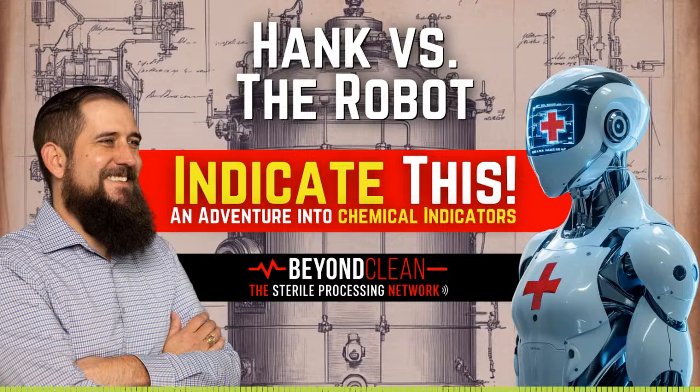You're onto something important here, Hank. The reliance on color change as a mode of interpretation has been both a strength and a challenge in the world of chemical indicators and integrators. Let's unpack why it's so common and whether we should be evolving to something more objective. Why color change? One, simplicity. Color change is intuitive. It's easy for sterile processing techs to glance at an indicator and quickly see whether it passed or failed. In a high-pressure environment, speed matters.